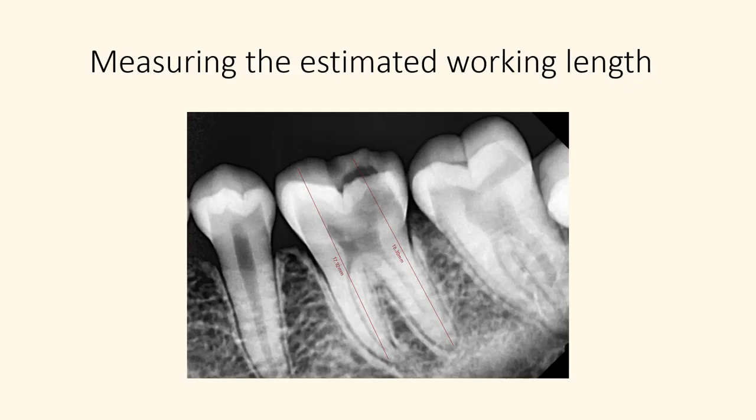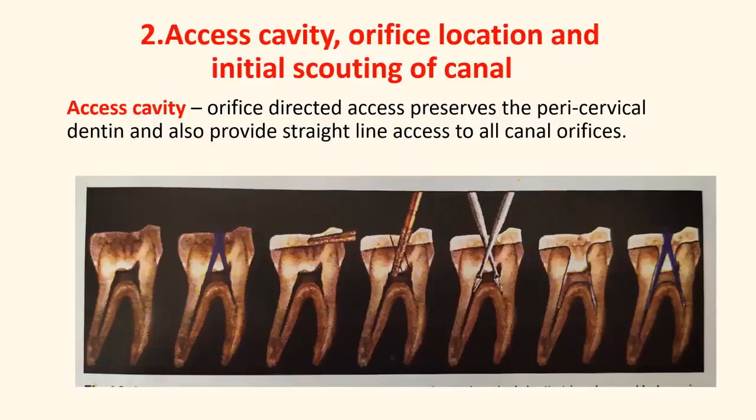Now coming to the second step, we will not go into detail about these steps. Access cavity, orifice location and initial scouting of the canal. Although all our access cavities are driven by caries, attempts should be made to preserve as much dentin as possible.